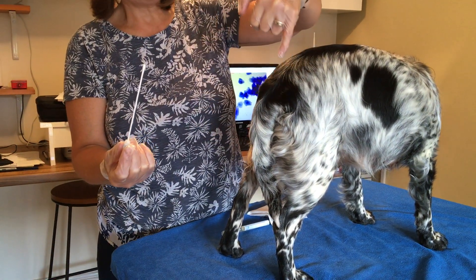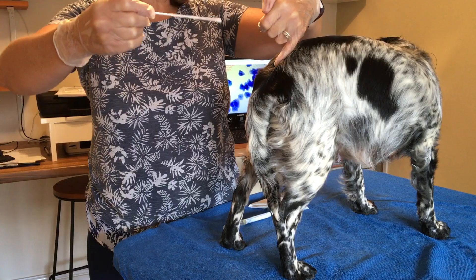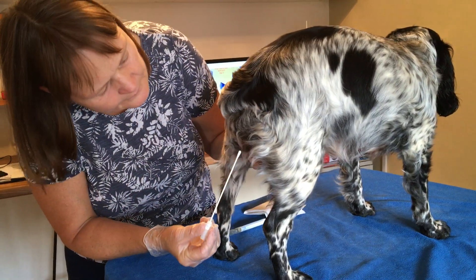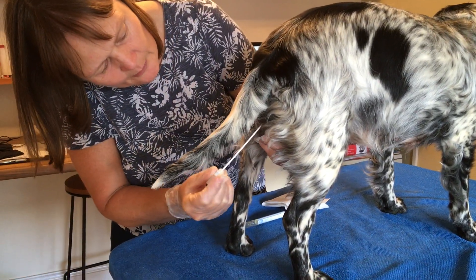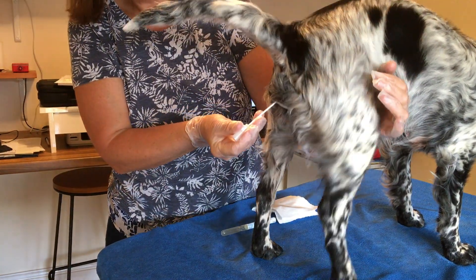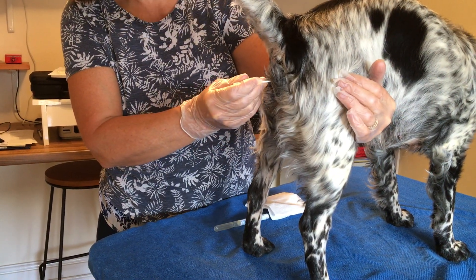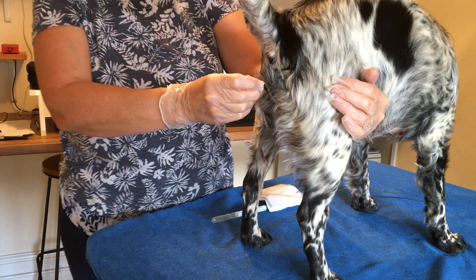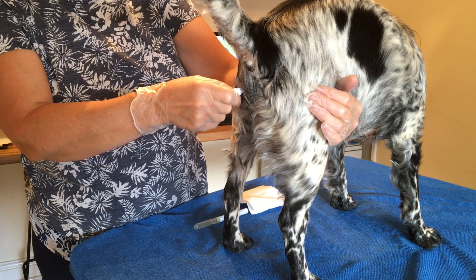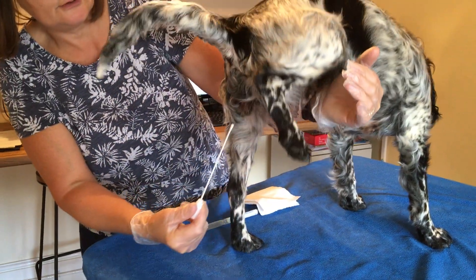What we're going to do with the swab is aim upwards to the top of the tail. When you meet the resistance, elevate the swab to go in straight. Now I've met the resistance — that's just the pseudocervix. Then just gently push through that pseudocervix all the way in. Having got it all the way in, just rotate your swab a few times just to pick up the cells. Then come straight back out and then lower it out of the vulva.